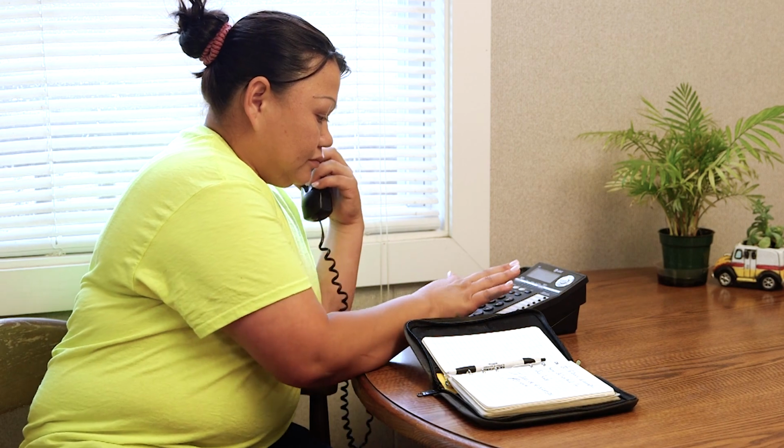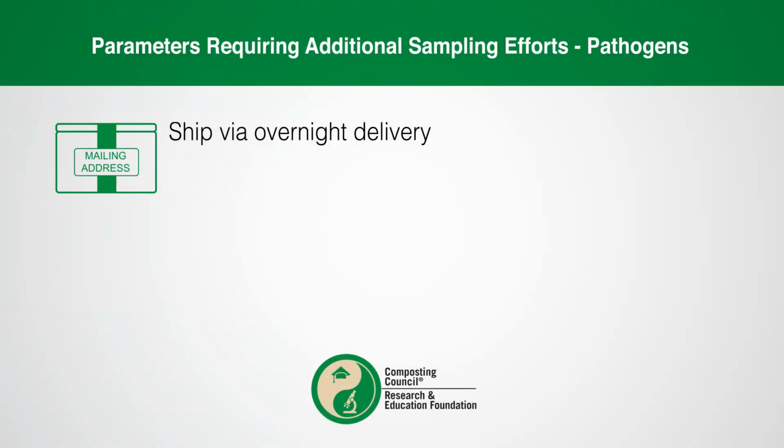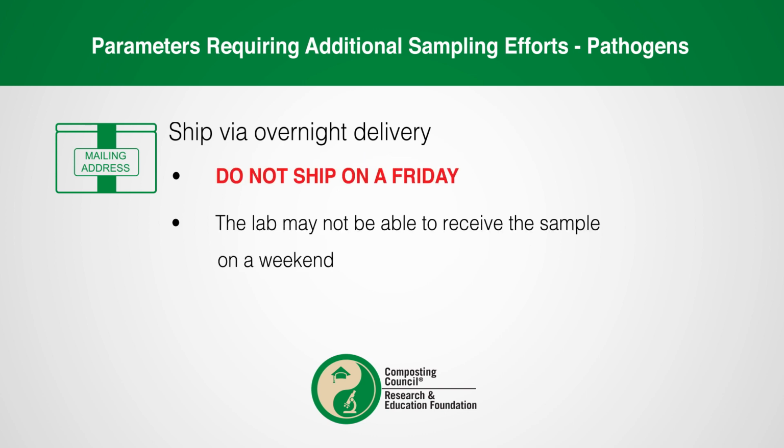Prior to collecting the sample, call the lab to let them know when they will be receiving the sample. Ship via overnight delivery and do not ship on a Friday. The lab may not be able to receive the sample on a weekend.